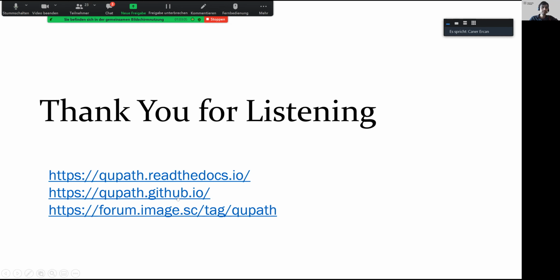Yes, thank you for listening. And on this website, in these places, you can see the official documentation of QuPath, or you can see the questions of other users and again, answers from the community. Thank you.